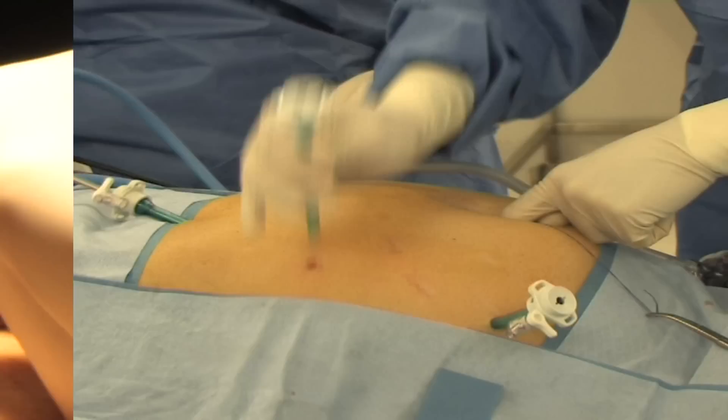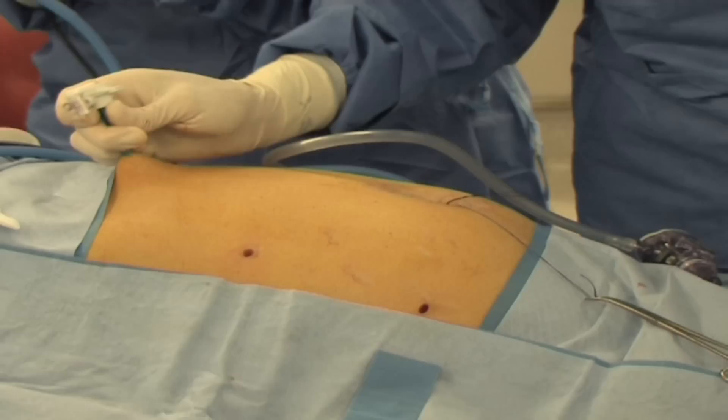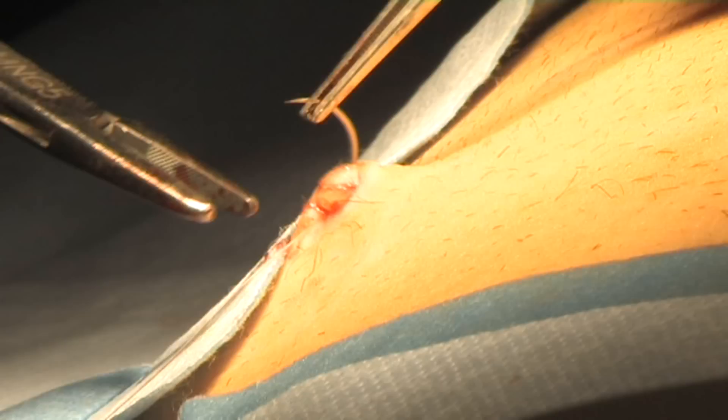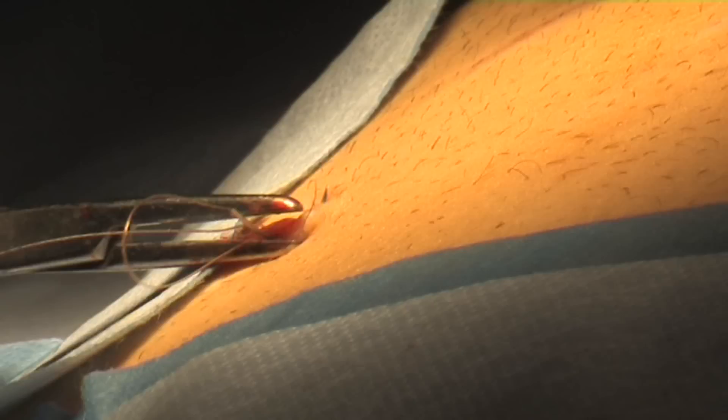All ports are then removed and any remaining gas is allowed to escape. The 10 mm port below the umbilicus and the three other 5 mm ports are then closed using dissolvable sutures that go beneath the skin. They therefore do not need to be removed.